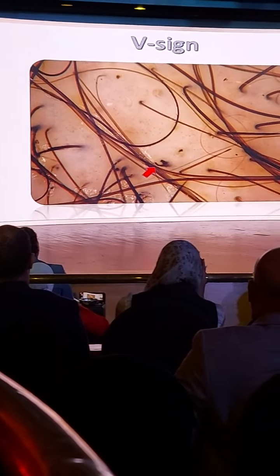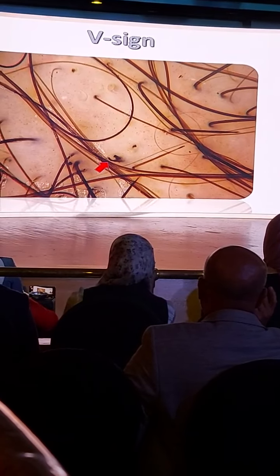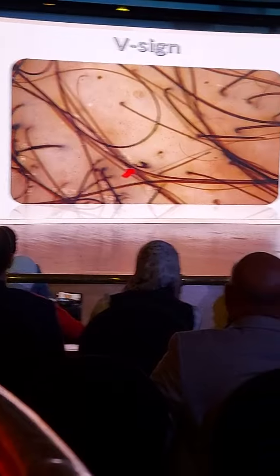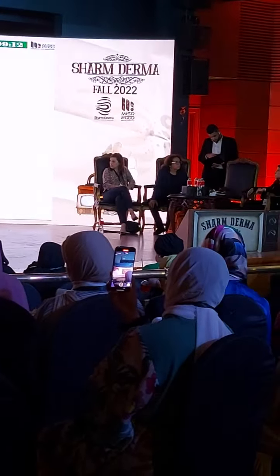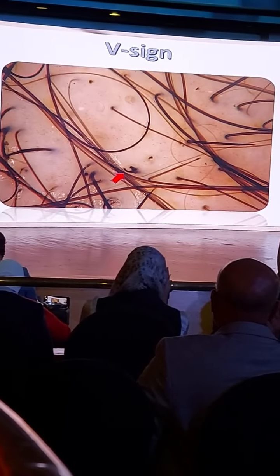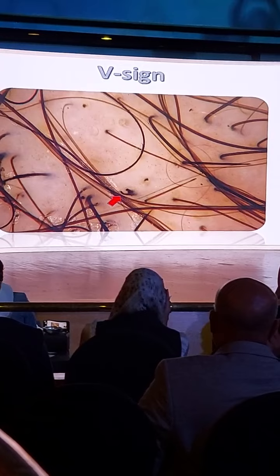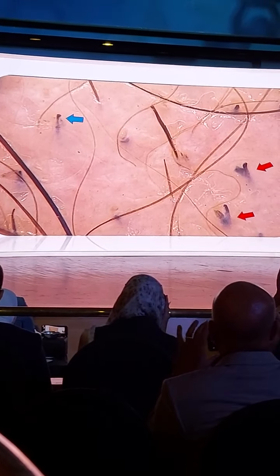So the V-sign, actually, these are two or three short hairs in one follicular unit, which is not so commonly seen in other hair shaft disorders. Even if you think about alopecia areata, usually you will see only one exclamation mark hair in one follicular unit. So for trichotillomania, search for the V-sign, so two or three short hair shafts in one follicular unit.